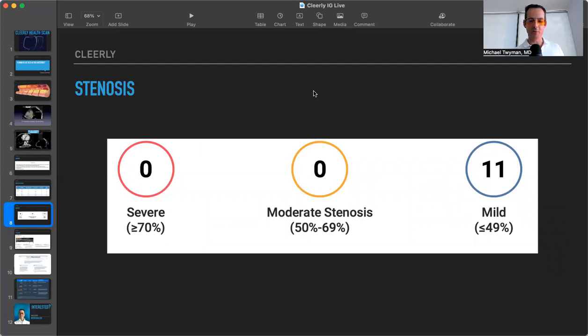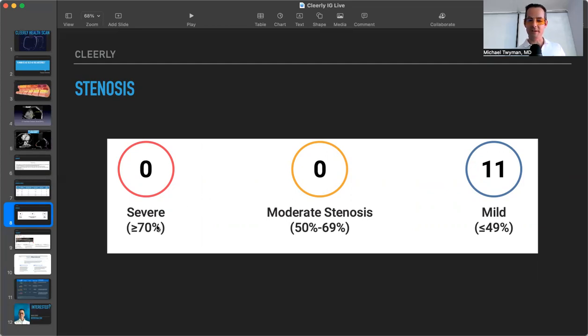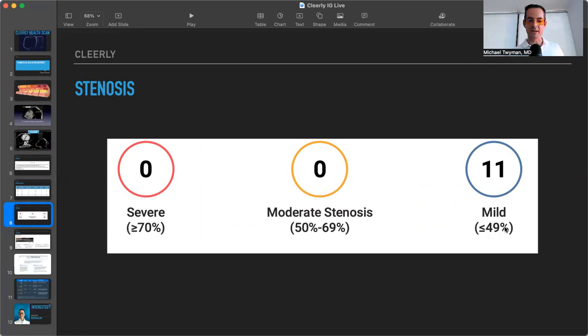Just your eyes drawn, there's no severe stenosis, so they quantify severe stenosis greater than 70%. A modest stenosis is between 50 and 69%, and a mild is less than 49%. So this individual had a few mild stenosis, maybe not surprising.